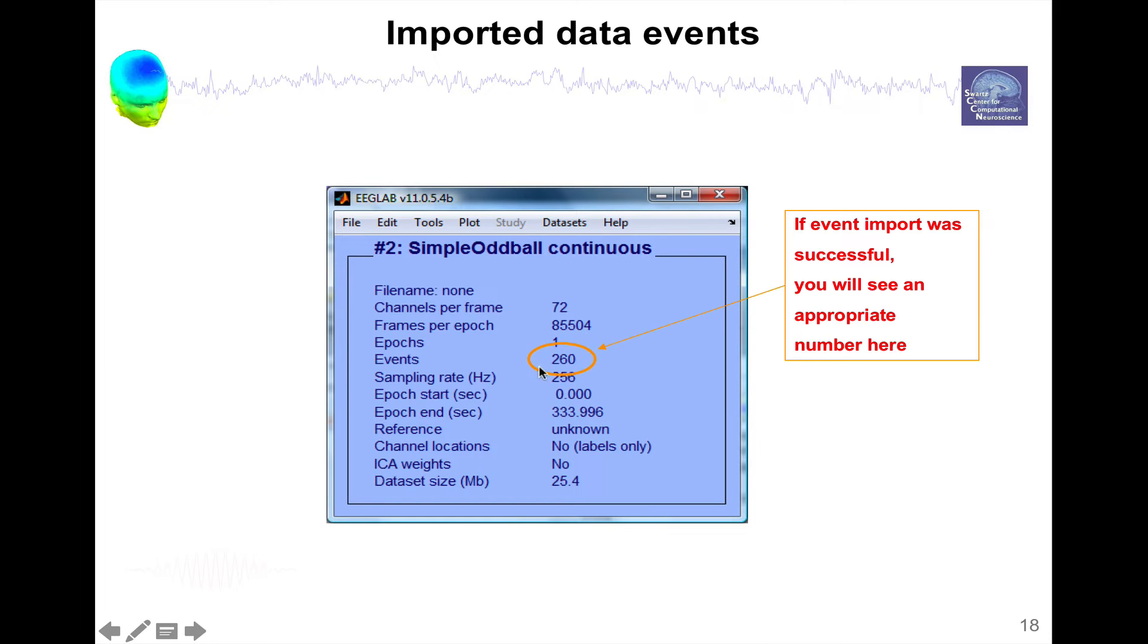Once you're done importing events, you should see events here. It's going to tell you the number of events that have been imported. Now what about channel locations?